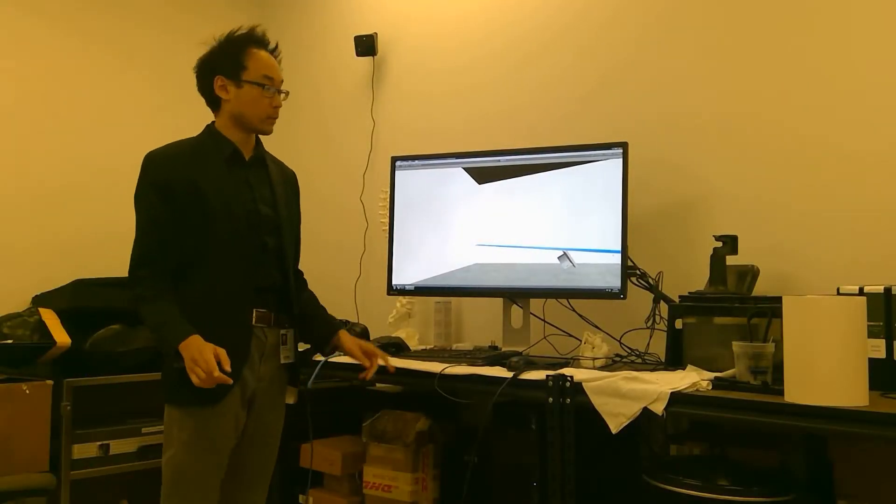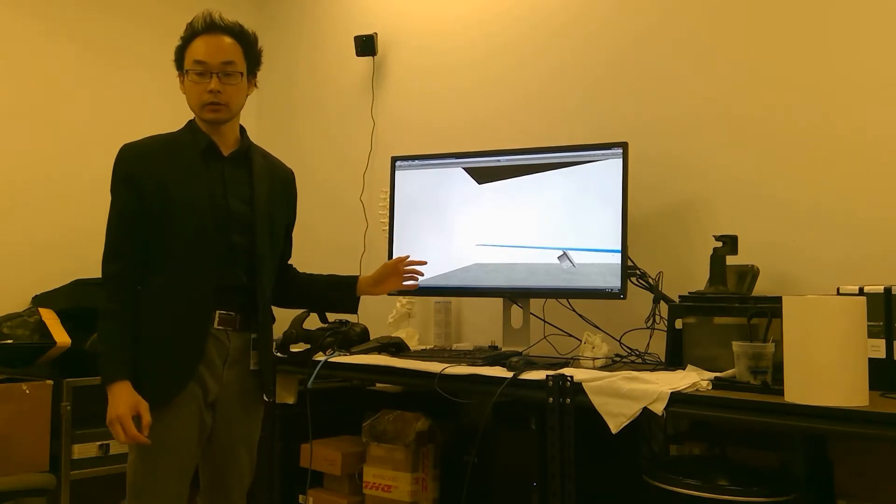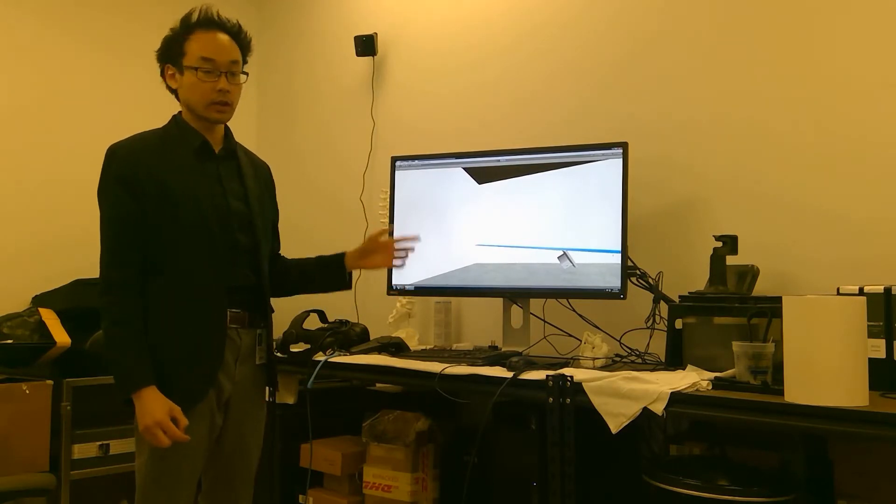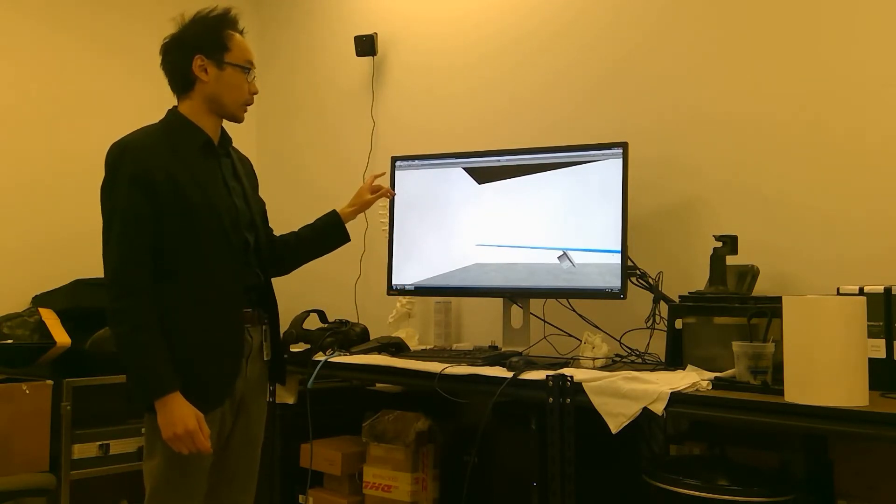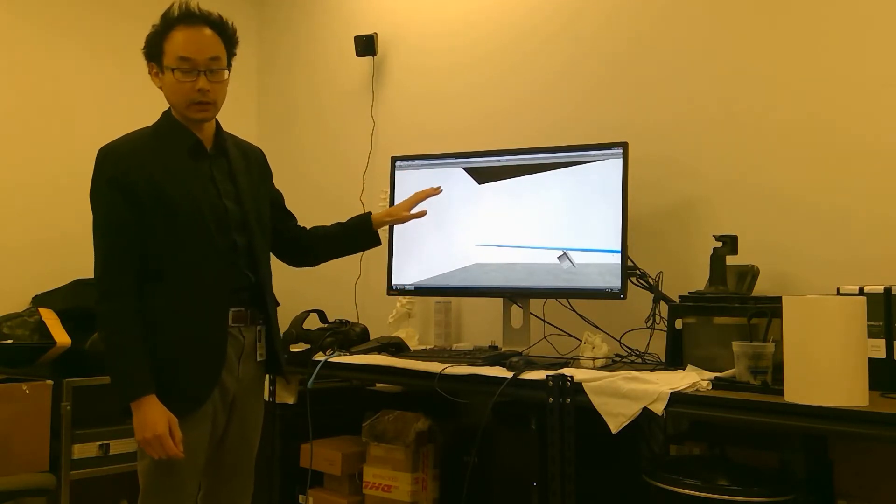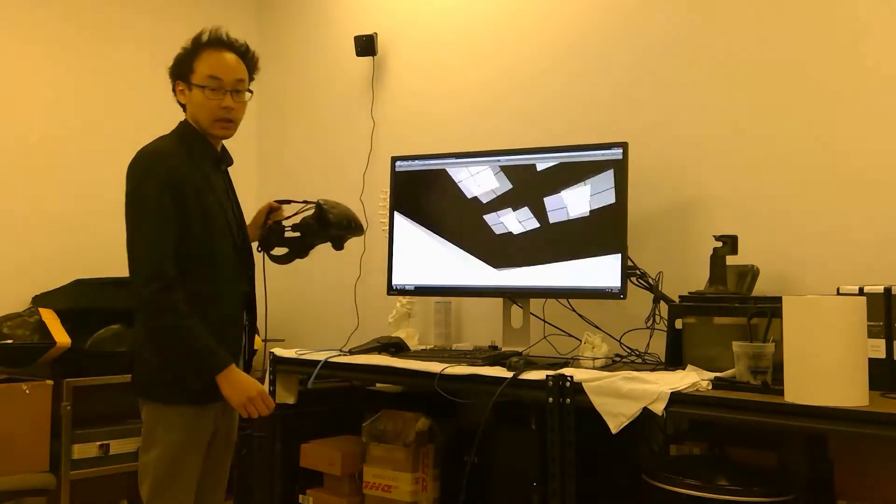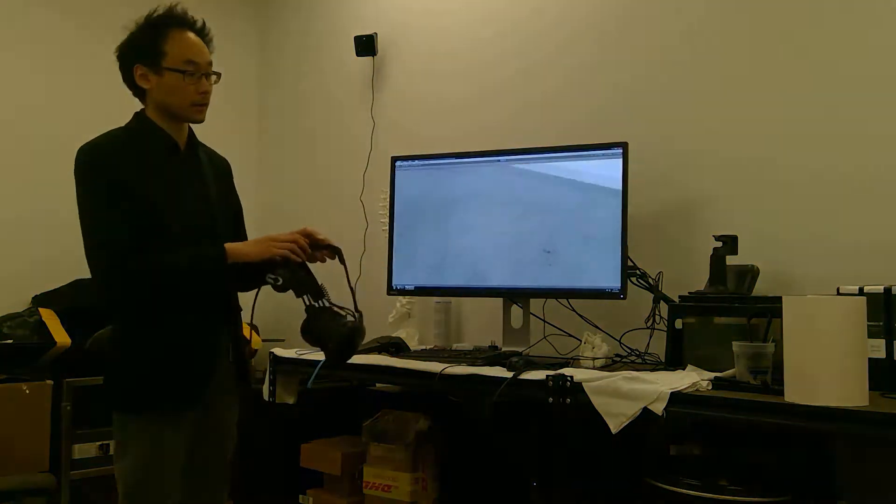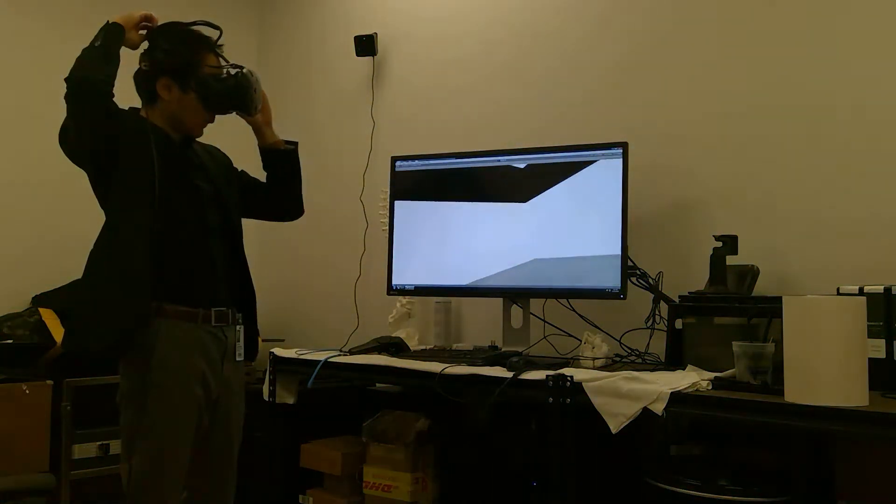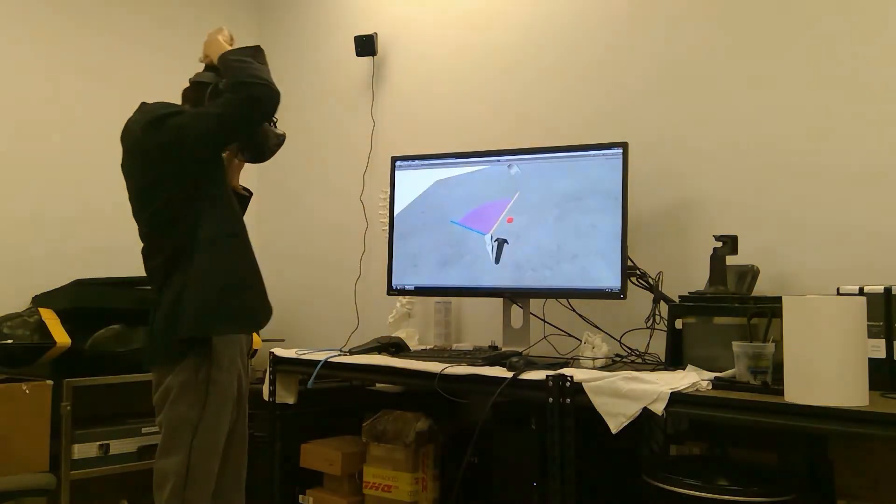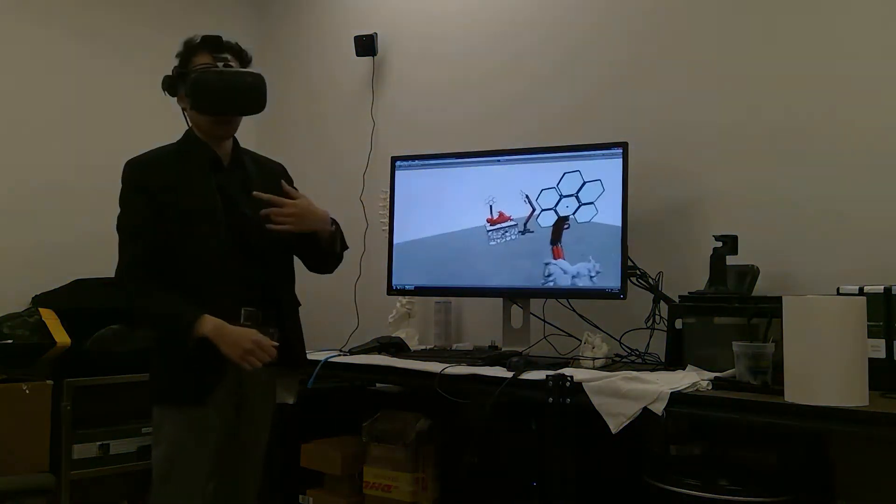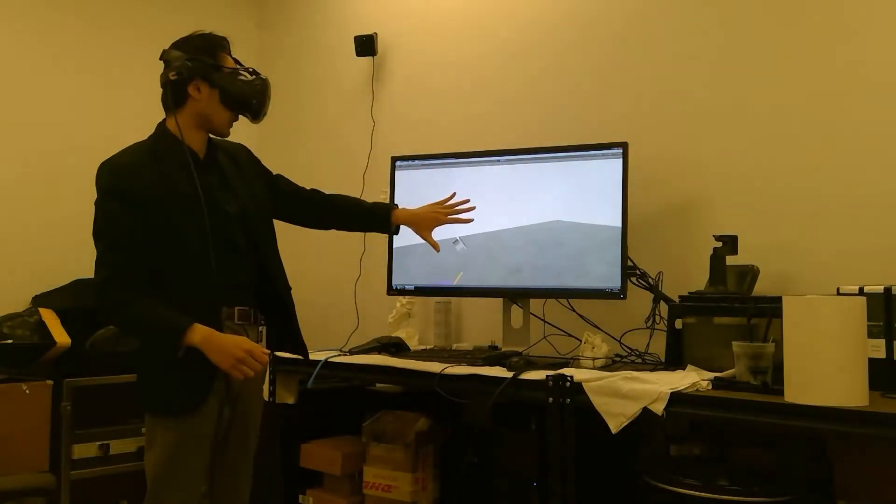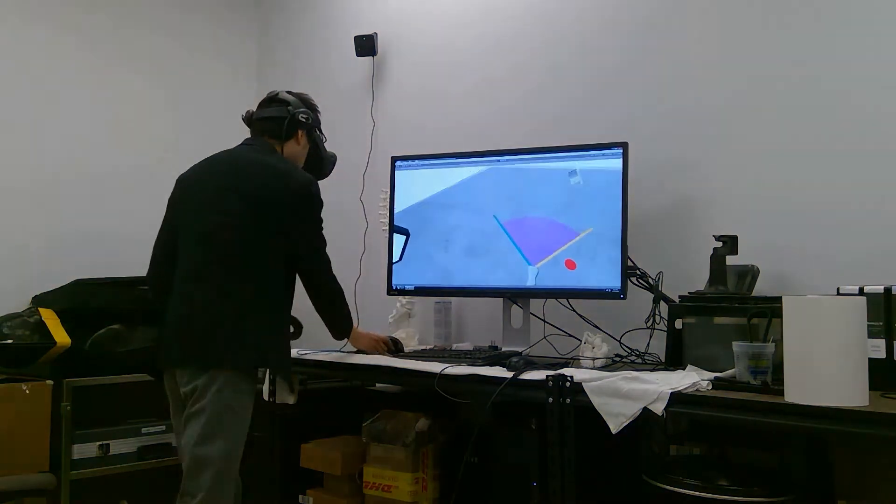Hi, so today we're going to be demonstrating our cardiac ultrasound simulator in VR. Right now we're just running inside Unity's editor and we're going to be using the HTC Vive for this. So as soon as I get my headset on, you'll be able to see what I see to some extent in this monitor behind me.